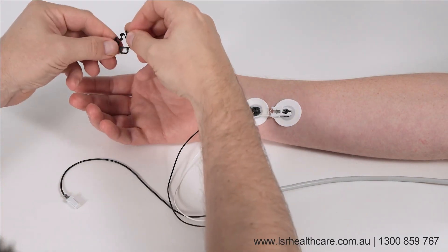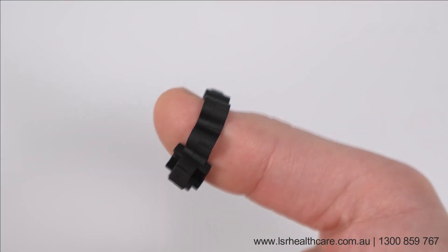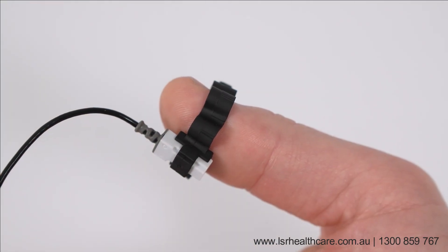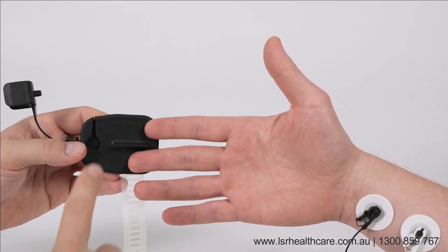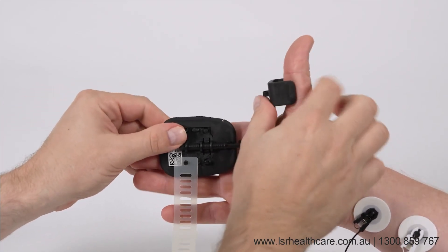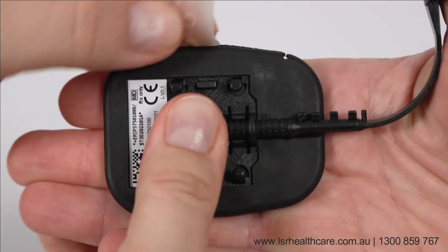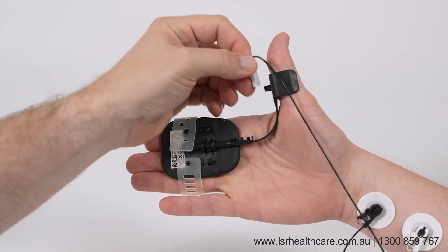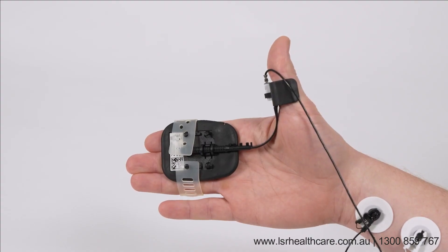Fix the acceleration transducer to the last segment of the thumb. You may use tape or the TOF3D thumb adapter. Put the hand adapter between the middle and index finger and wrap the silicone strap around the fingers. Do not pull the strap too tight to avoid pressure marks. The hand setup is complete.